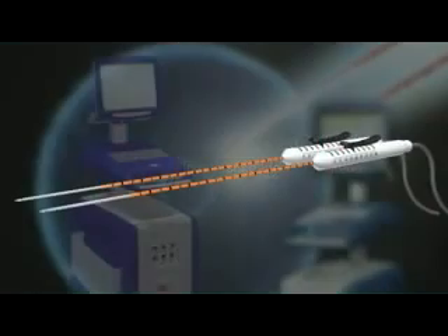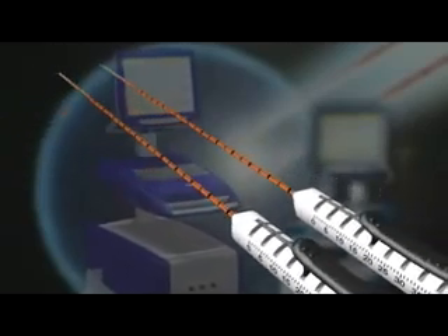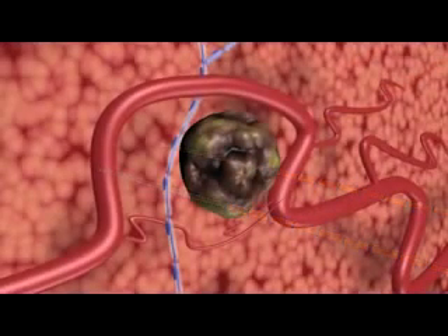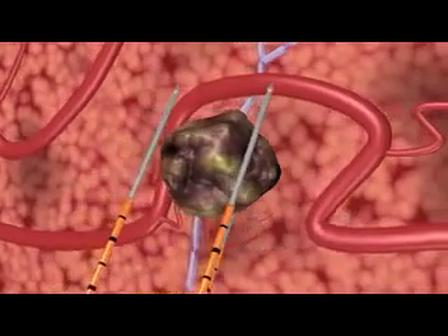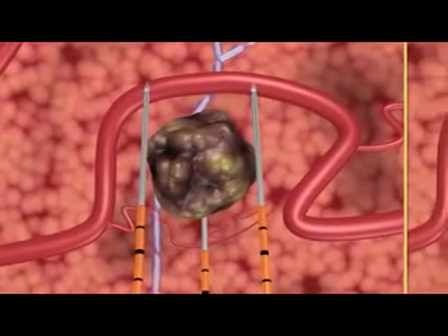The NanoKnife IRE surgical ablation system is the first to use irreversible electroporation, also known as IRE, to ablate soft tissue. Two or more NanoKnife IRE disposable electrodes are positioned in or around the area to be ablated, and an electrical field is created between them in a series of microsecond pulses, which induces cell death in the encompassed soft tissue.